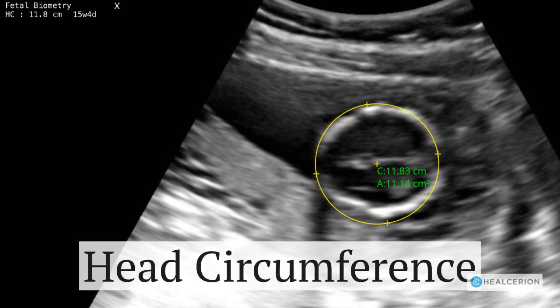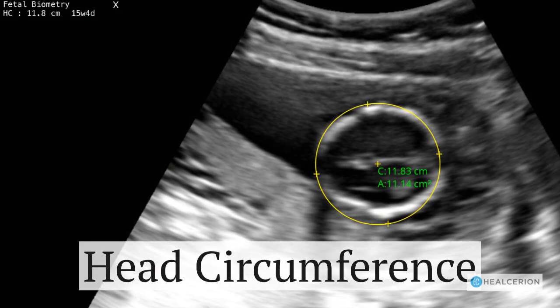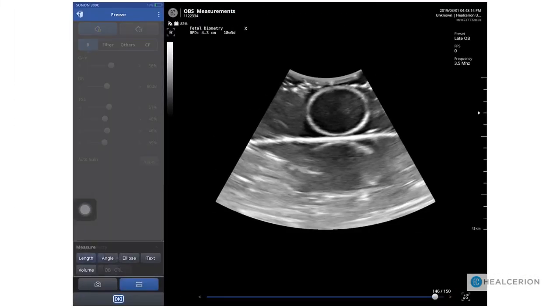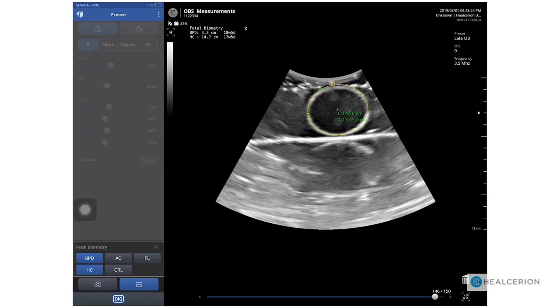Now we'll look at how to do head circumference. Achieve the image required. Again open up the measurement menu, OB, and now choose head circumference. Tap to place your first caliper. Place the second and then use the light gray dots to reposition the calipers accordingly so that you get the correct measurement.